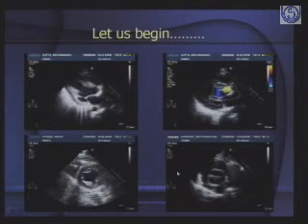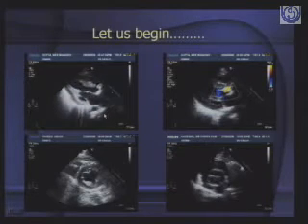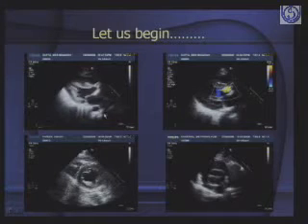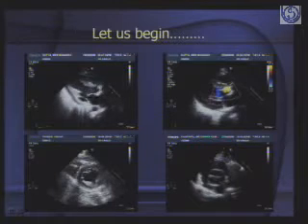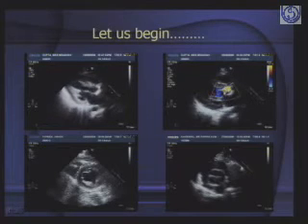So first of all, when you have a patient of aortic regurgitation, what do you do? Put him in the parasternal long axis view. You have taken the history, you have done the ECG, X-ray chest, clinical examination. First is the parasternal long axis view. Look at this quadrant here. Good contracting LV, mitral valve is normal, and you see echoes here which you are not sure what it is, but as soon as you put the color Doppler, you see aortic regurgitation.